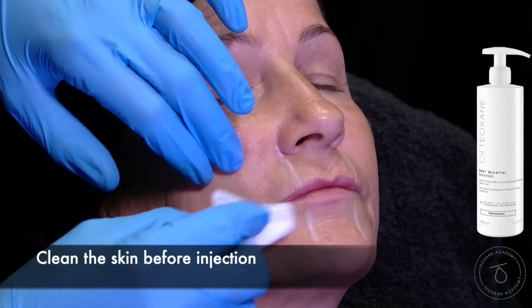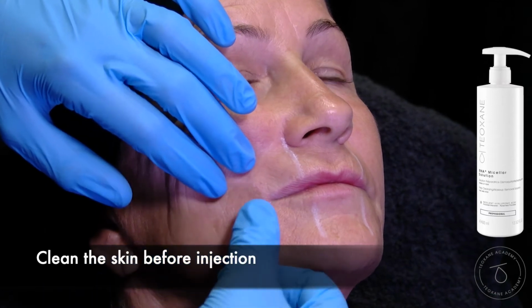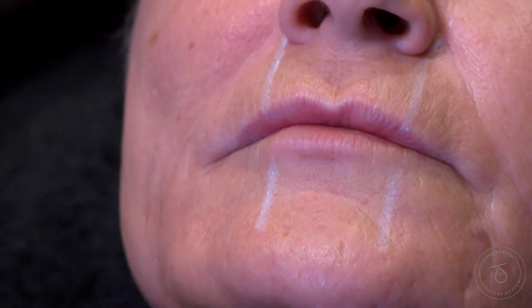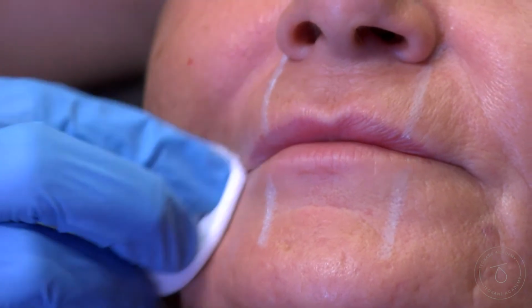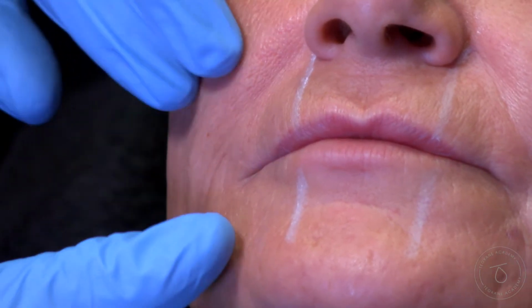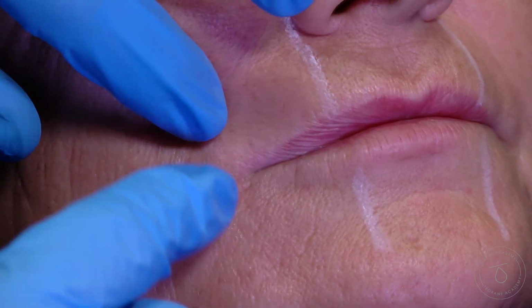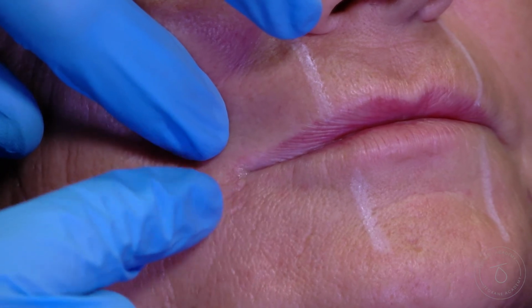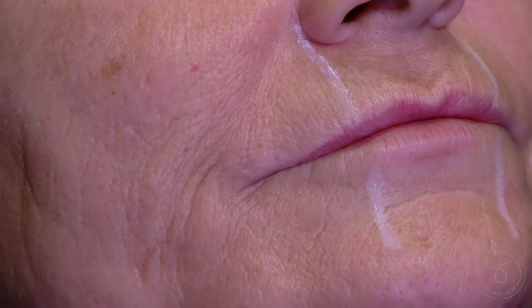So we're going to go ahead and start our treatment. I'm just going to go ahead and disinfect. And my entry point will be here, just about 1 centimeter lateral to the oral commissure. And if I can just ask you to smile here for me. So we know that here the modiolus, that's usually where the artery gives off its branches there. And I'm sure you probably have a beautiful slide there, Patrick, to show us for that. So I'm going to be about 0.5 centimeter to 1 centimeter here, just lateral to the oral commissure for my entry point. Okay.